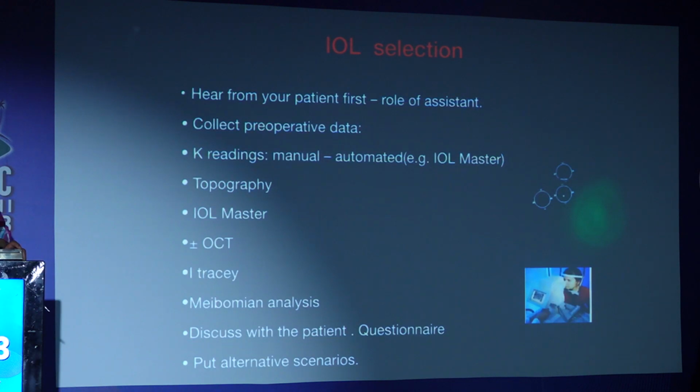My practice has boiled down basically to monofocals. With monofocals, I always go for advanced monofocals and advanced monofocal torics. And when I go for presbyopia correcting IOLs, it is limited to basically EDOFs. EDOFs are for those patients who have a bad macula, glaucomatous patients, hypercritical patients, patients demanding night driving, abnormal pupil sizes, and uveitic patients. I think these are great candidates for EDOF lenses.